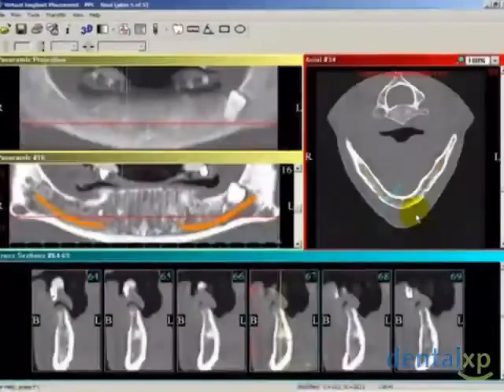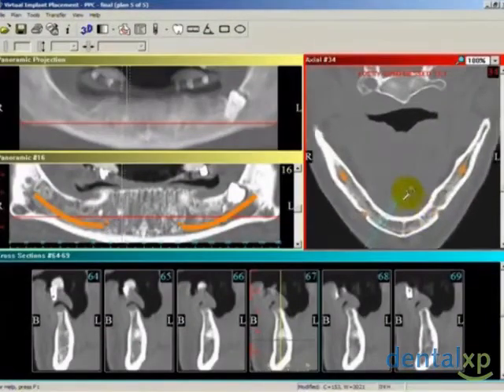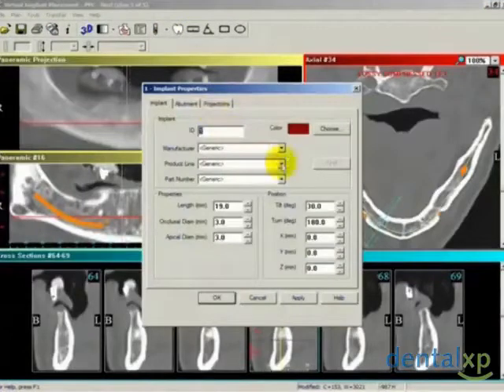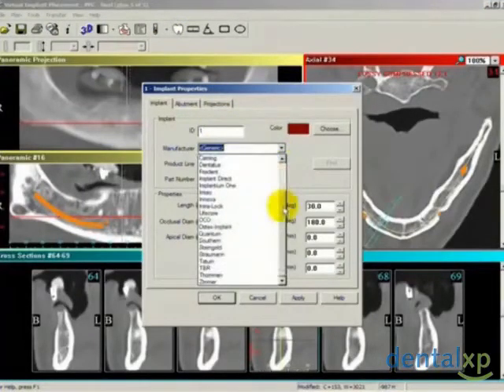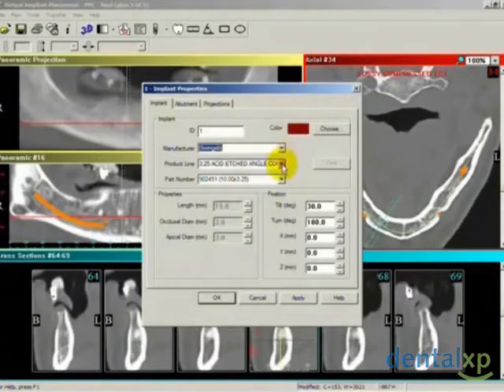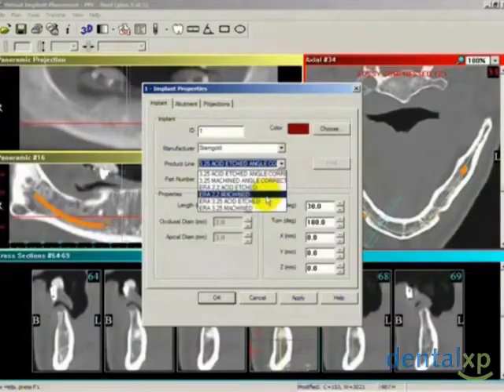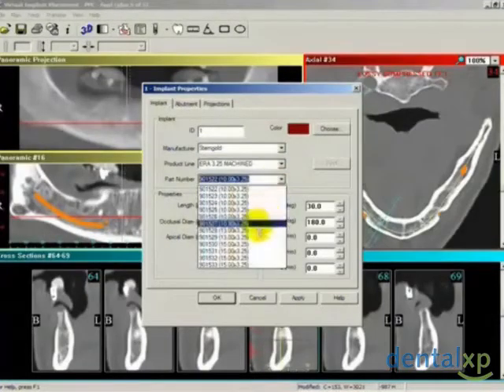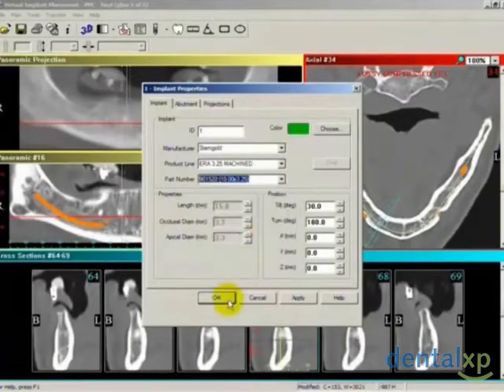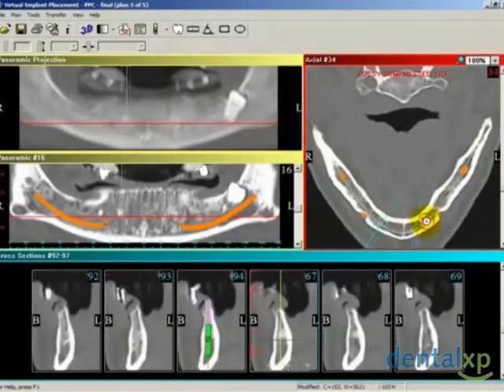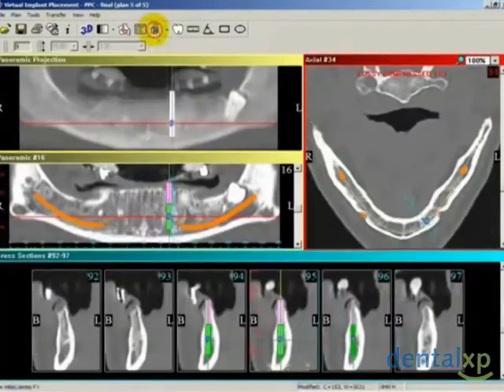Enlarging the image facilitates the placing of implants. Defining a default implant speeds up treatment planning in multiple implant cases. First, select Sterngold from the manufacturer list, choose a product line and part number, and notice the implant dimensions alongside. We are selecting 3.25 millimeter implants. Saving the settings allows us to focus on positioning the implants with minimal time and effort.